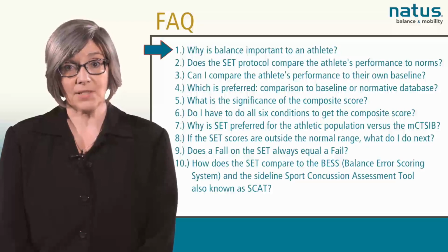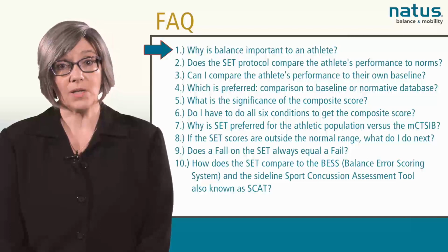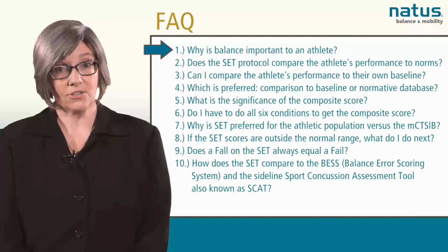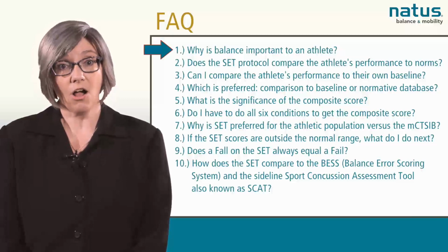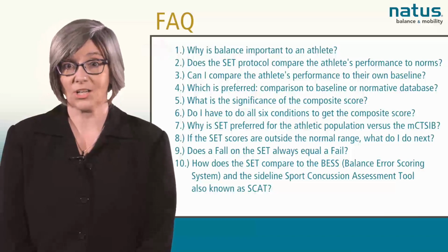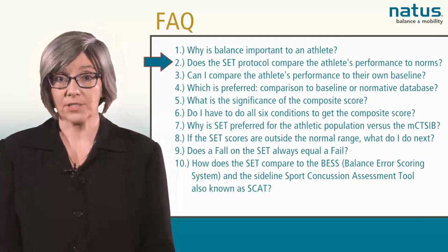Current best practice recommendations from the NCAA and NATA support a three-pronged approach based on symptoms checklist, standardized cognitive processing exams, and balance assessment. All three are required for making a return-to-play decision post-concussion. Does the SET protocol compare the athlete's performance to norms?